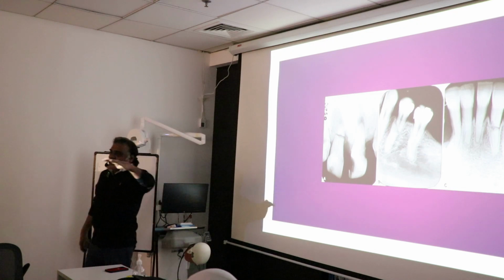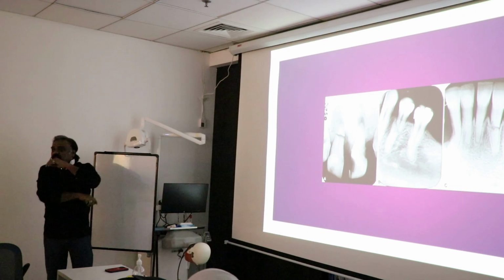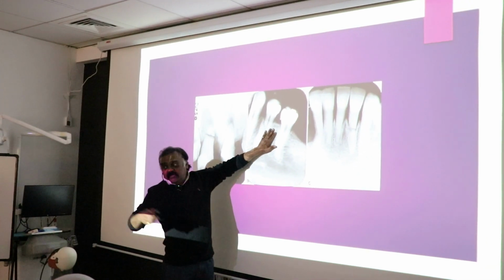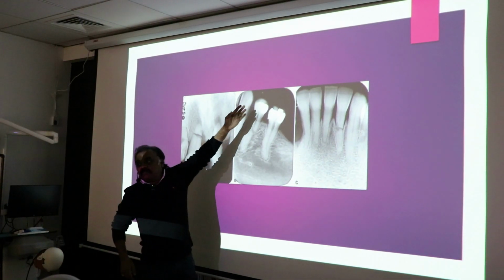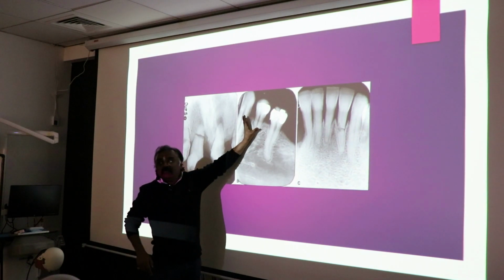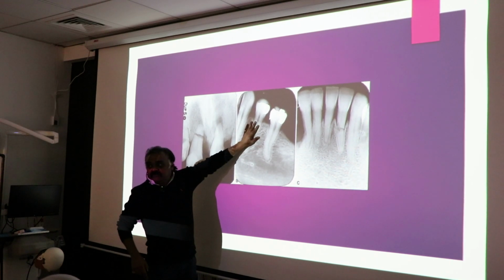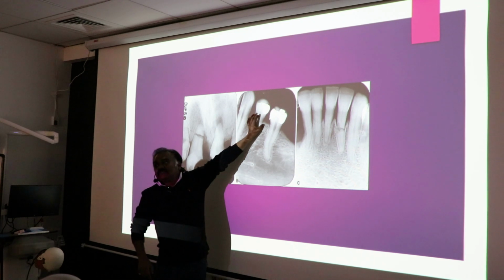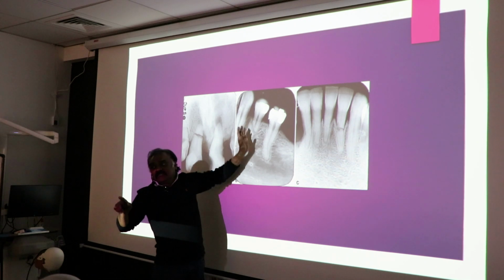Orthodontic extrusion can also be done for situations where you're going to have rapid extrusion. In these kinds of cases, if you want to replace this tooth, you do a root canal, and as you rightly said, you can use an elastic to bring it out. You can just put an attachment here and bring it out. In this, we are not waiting for the entire segment to move. We are not waiting for the bone or the soft tissue to move. There's nothing wrong with the bone or the soft tissue here, but I do not have sufficient tooth structure to replace it. So my idea is to move this tooth as fast as possible. That's called rapid extrusion, where I do not wait for 1 millimeter every month. I just pull it as fast as I can.